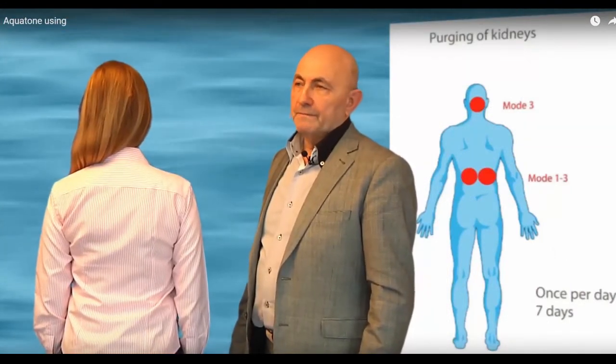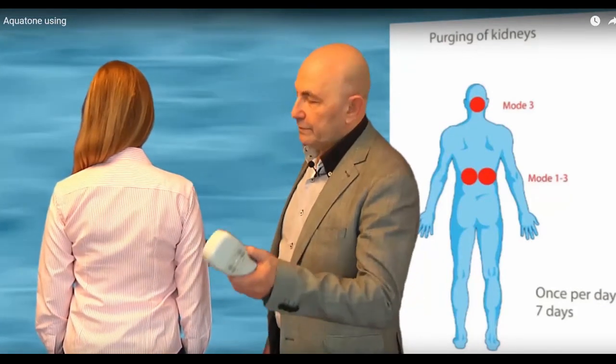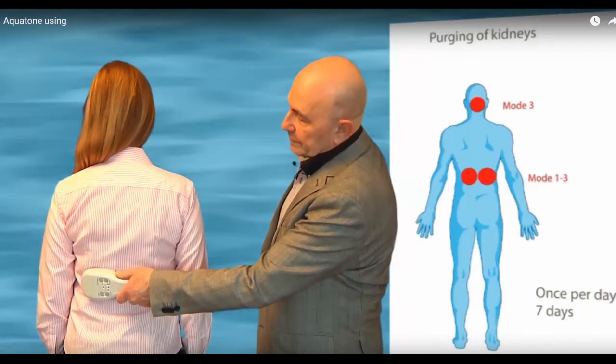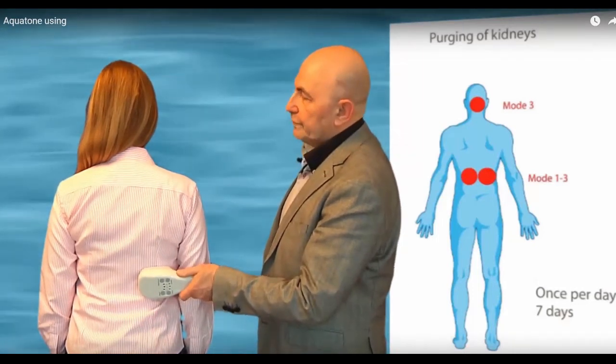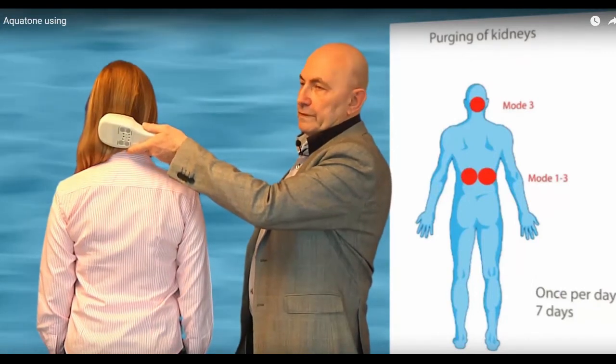It's also important to cleanse the kidneys. The kidneys filter our blood, and it's important that this filter functions well. Place the device on the kidneys, 10 minutes on each. After that, as usual, treat the back of the head.